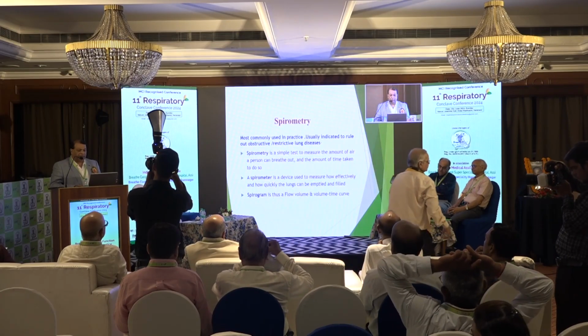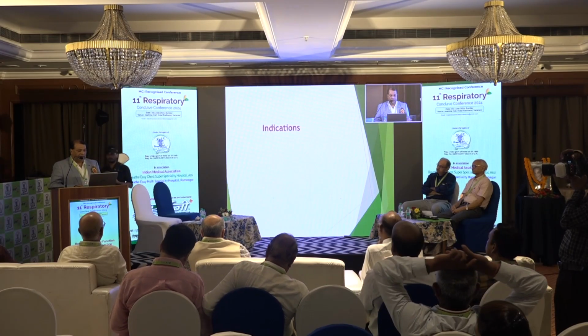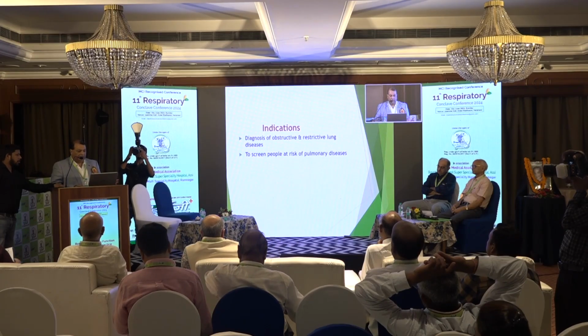So, sir, spirometry is very important. It works like an ECG of the lungs. Just as we know the cardiac status by ECG, we are doing the ECG of the lungs by spirometry. The indication of spirometry is generally diagnostic, to rule out obstructive or restrictive lung disease, and to screen people at risk of pulmonary diseases.